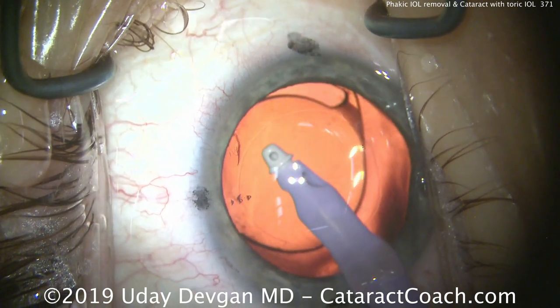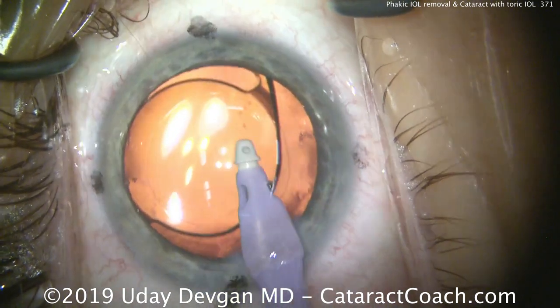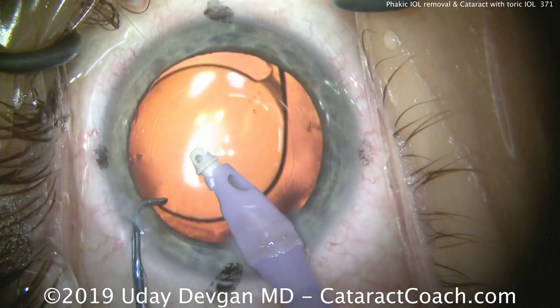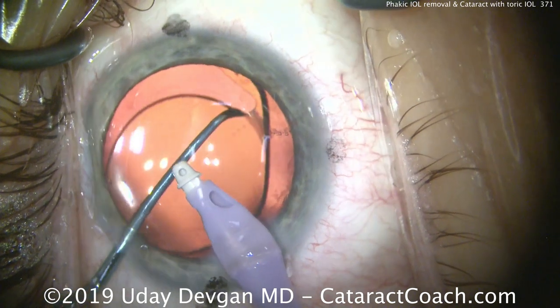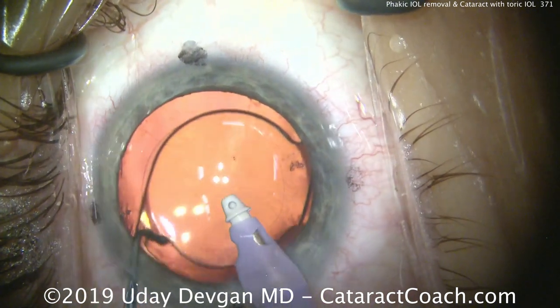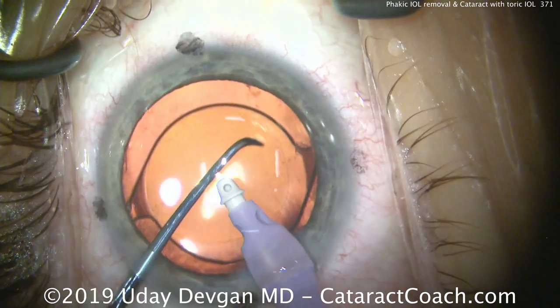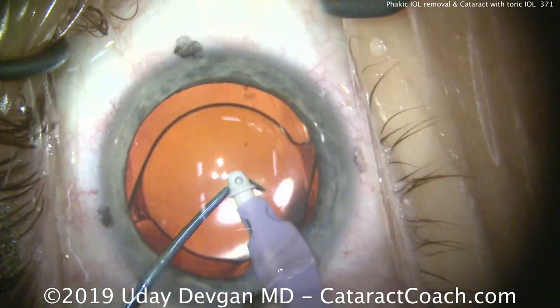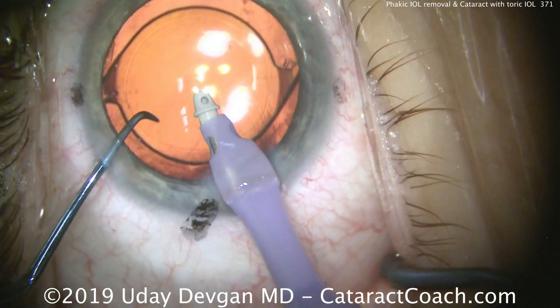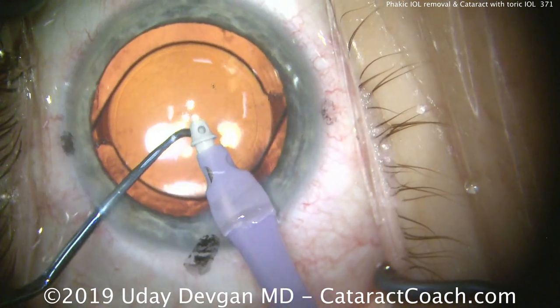Now we're ready to get our second instrument — the chopper — into the eye. We'll rotate that lens into its final position with the foot pedal on position one, just irrigating, and use the chopper to gently nudge the lens. The lens itself has three dots for toric marking, and we'll line those up with the three dots placed on the cornea previously to give us perfect alignment. Confirming alignment — that looks great. We can nudge it one way or the other to dial it in even more.